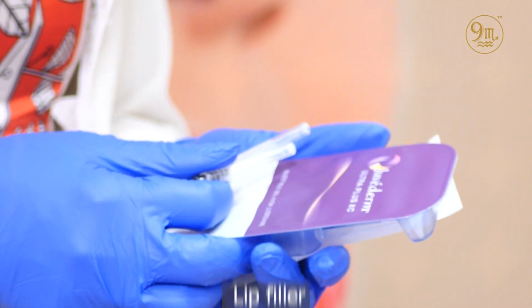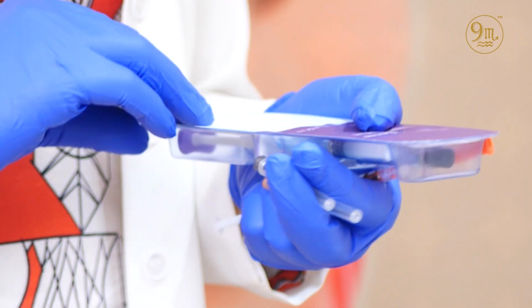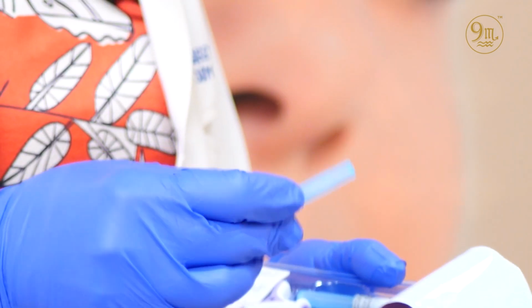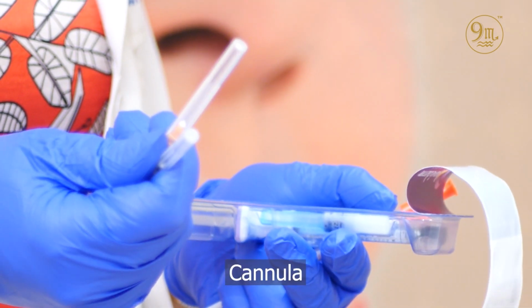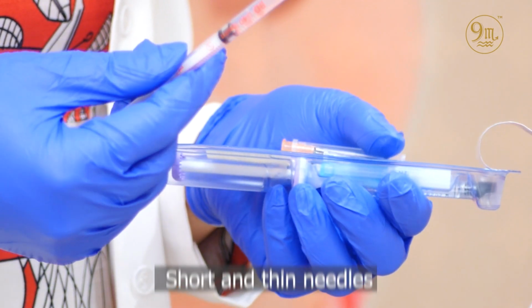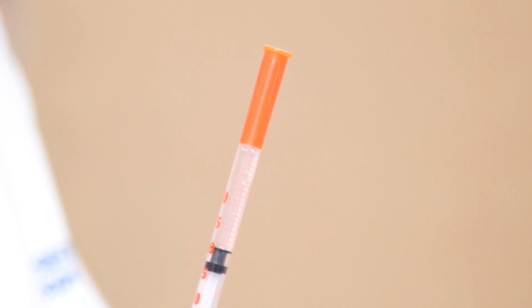So we are doing a filler for lips, and we have 3 options. Either we use these needles, which are like long needles, or we use a cannula, or we use very short needles and very thin needles. So like these.